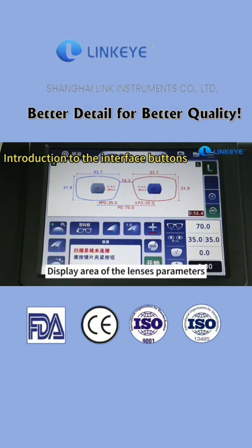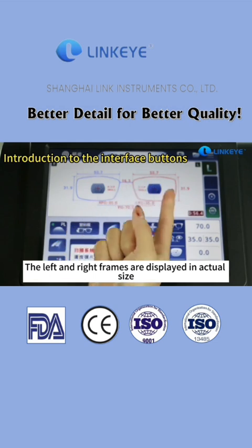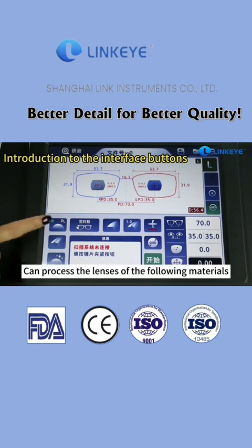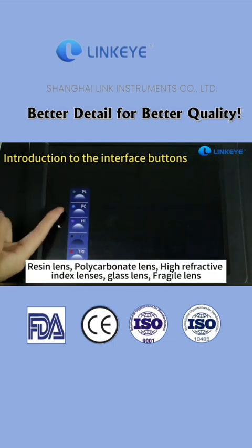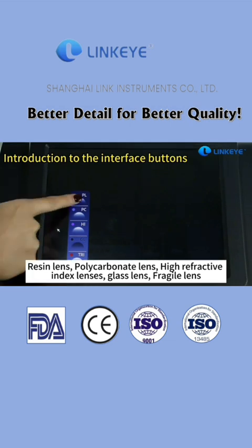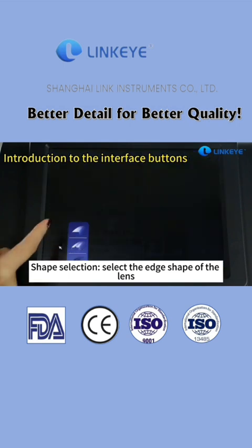Display area of the lens parameters. The left and right frames are displayed in actual size. The red outline shows the processing side. The edger can process lenses of the following materials: resin lens, polycarbonate lens, high refractive index lens, glass lens, fragile lens. Shape selection: select the edge shape of the lens.